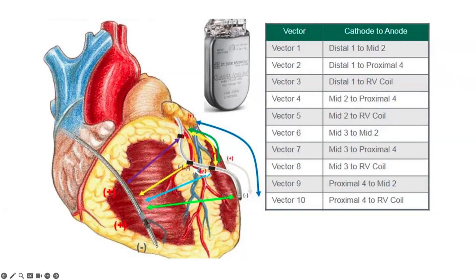So Dr. Ngwu, just really quickly so I can redeem myself. In a very odd case, not very small cases, there was a congenital patient with diaphragmatic twitching all the time in all the different vectors that you could think of. And there was a little bit of a safety margin, like Gerald was saying, not too much. So the LV output was set at 2.5 and the threshold was about 2.2. It is possible to put the LV output at maybe 2.3 or 2.4 and then decrease the pulse width only slightly. And that got rid of the diaphragmatic twitching. So it's worth trying that.